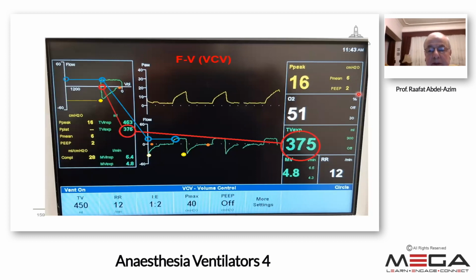See what is there. Flow volume. So this is the volume here displayed in numerical display. You can see it here at the point maximum reached, starting from 0 to its end. Here it is 375 milliliter. And the flow, we can see the constant flow here, reaching from 0 flow to its peak or peak inspiratory flow. This value will be displayed here at the top of the display on the loop on the left side.